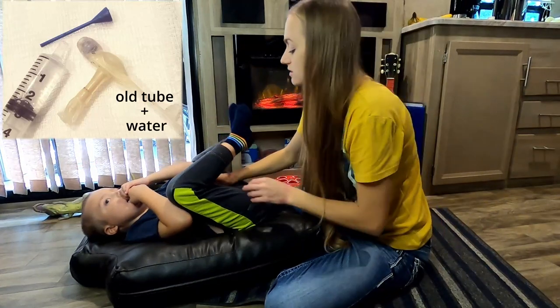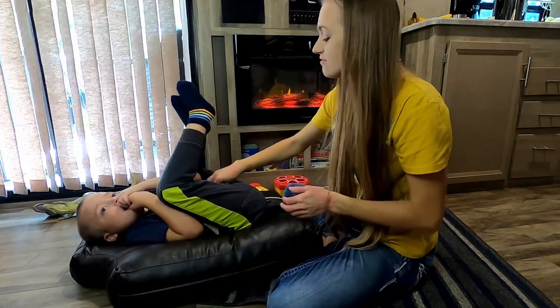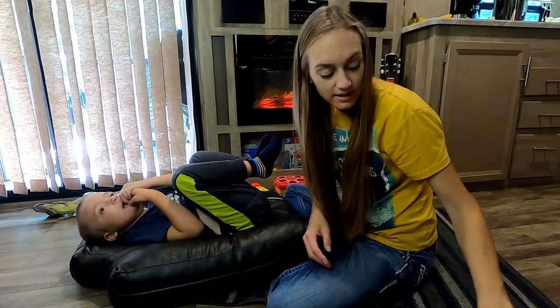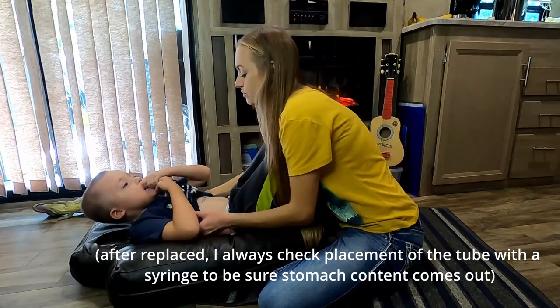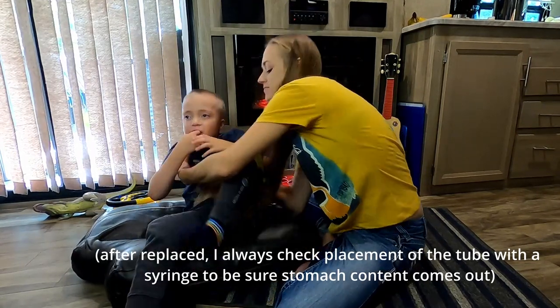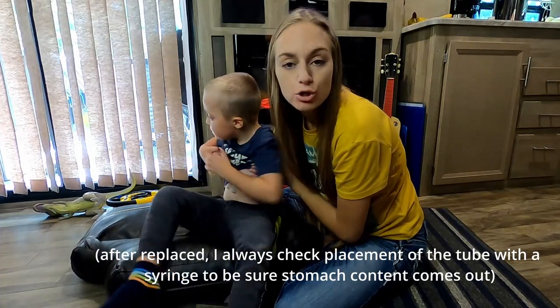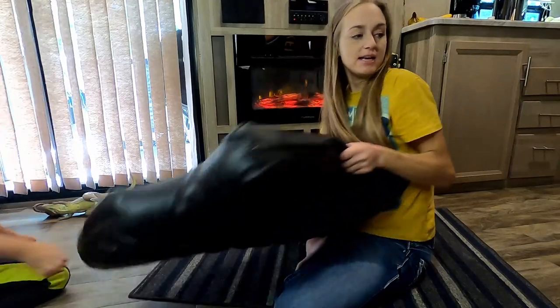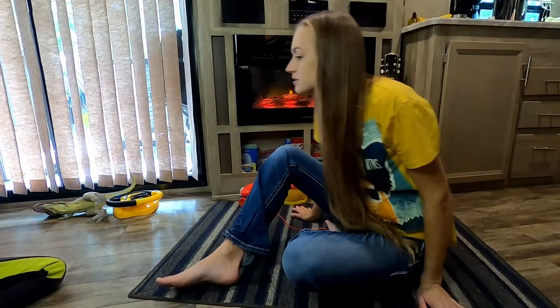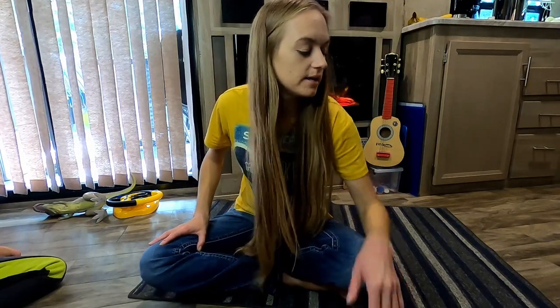So then I'm just gonna wipe the excess jelly off. And that's it. That's literally it. I just did it. All done. Boom. Show them your fresh tube. Boom. New tube. And it's ready to be done. That was it. We are done, done, done.